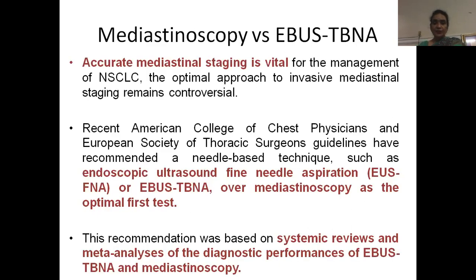Accurate mediastinal staging is vital for the management of non-small cell lung cancer. The optimal approach to invasive mediastinal staging remains controversial. Recent American College of Chest Physicians and European Society of Thoracic Surgeons guidelines have recommended a needle-based technique such as endoscopic ultrasound fine needle aspiration or EBUS TBNA over mediastinoscopy as an optimal first test.